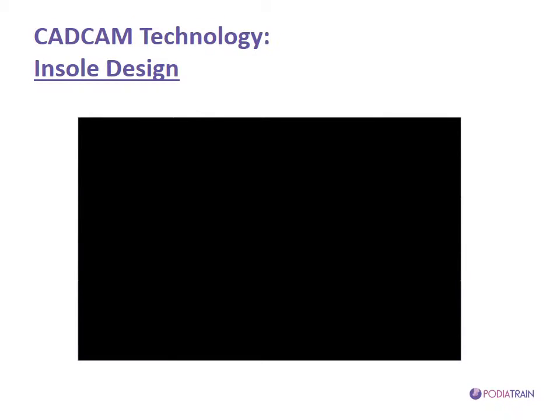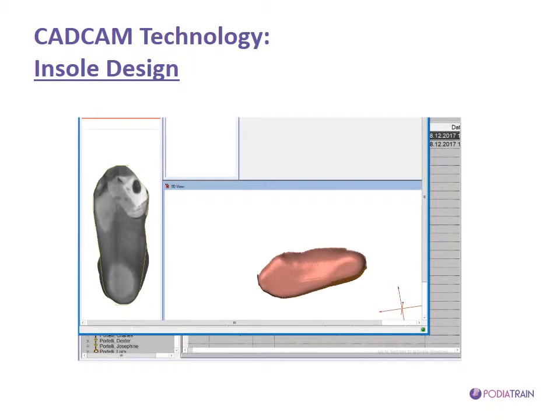So for the purpose of designing this insole, as you will recall, we have marked the location of the ulcer, which, as we said, is slightly distal to the first MPJ. Since we had to cover the area in order not to get an infection, it was important to mark the exact location of the ulcer.